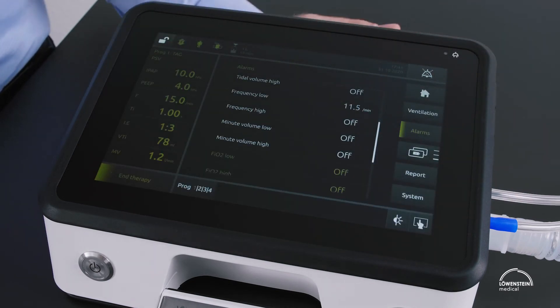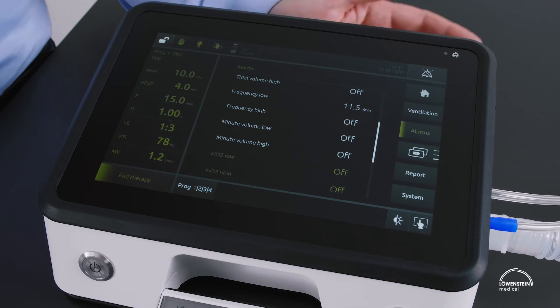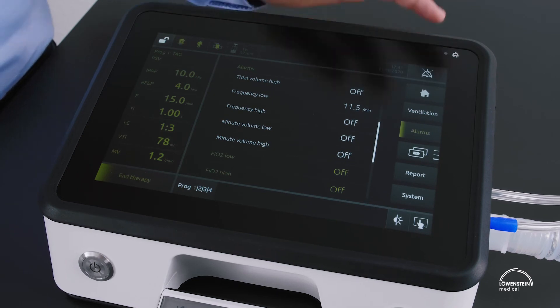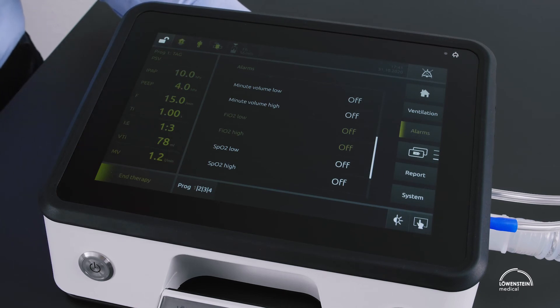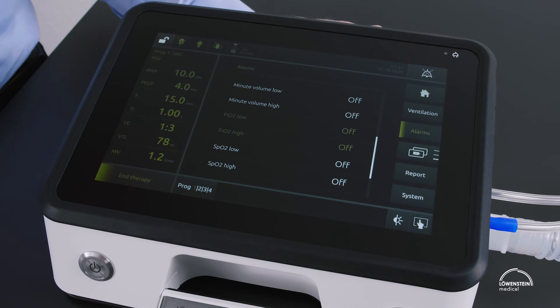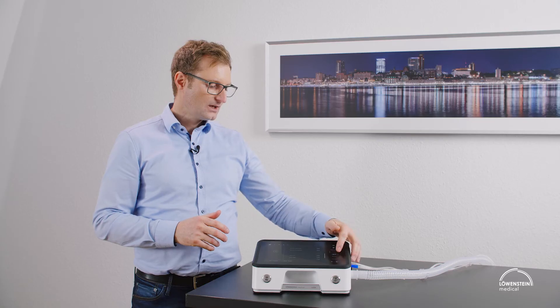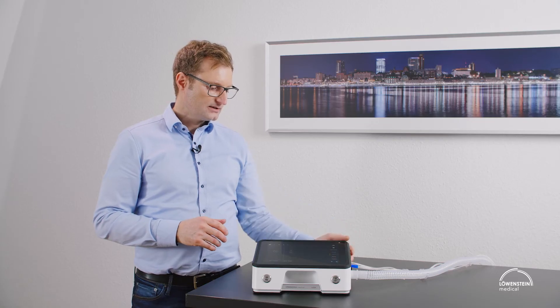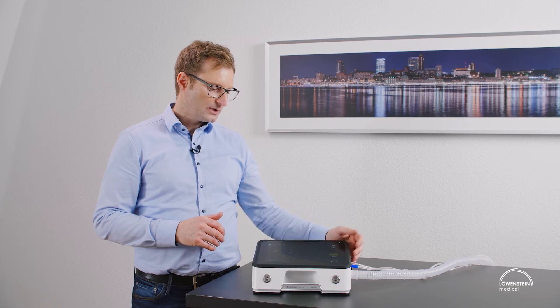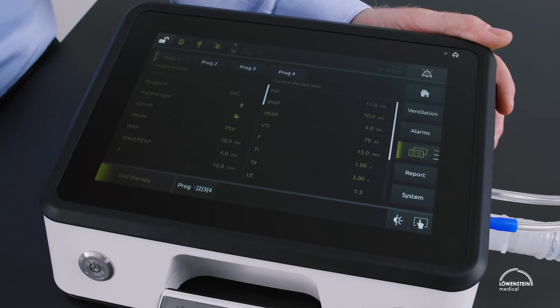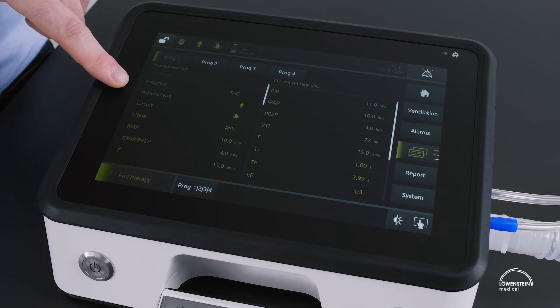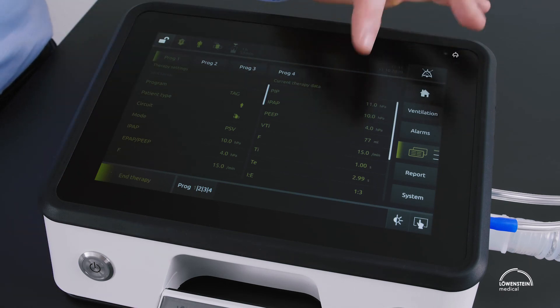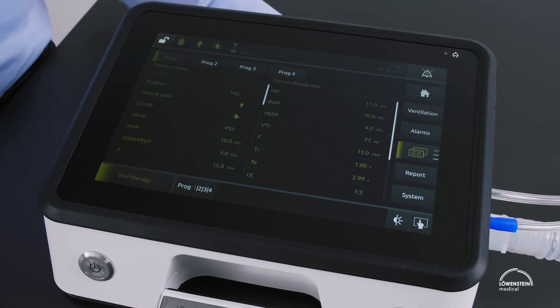We can do this for all alarms. If an alarm is displayed in green, the alarm cannot be set — like the FiO2 low and high alarms here, because the FiO2 cell is not activated. Next are the different views. For documentation reasons, there is a list of actual values next to the list of set values.